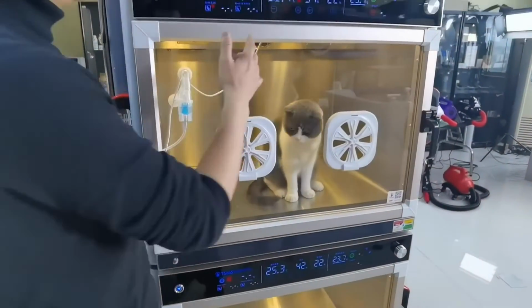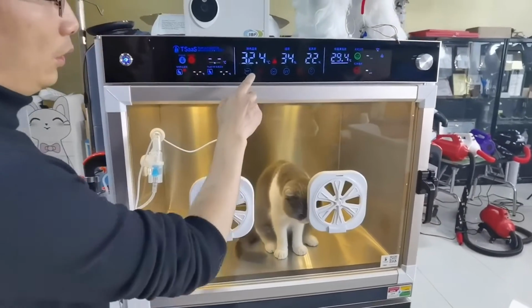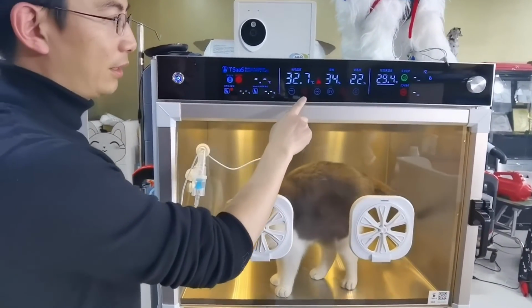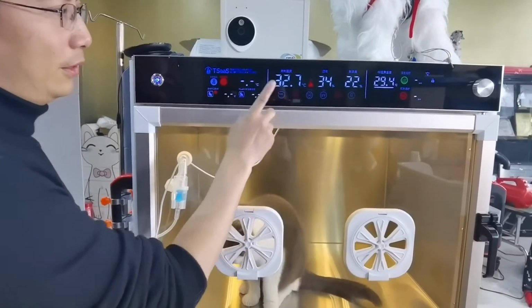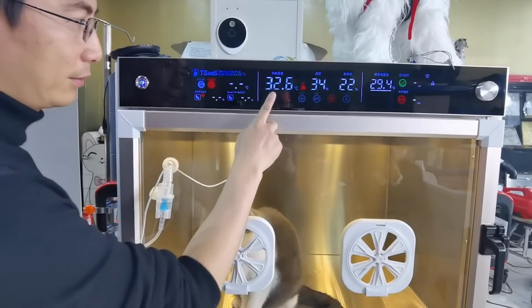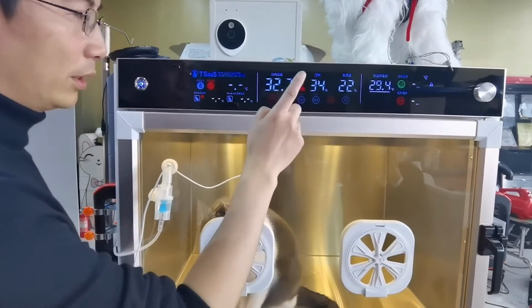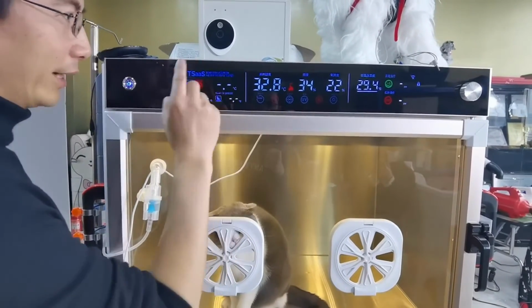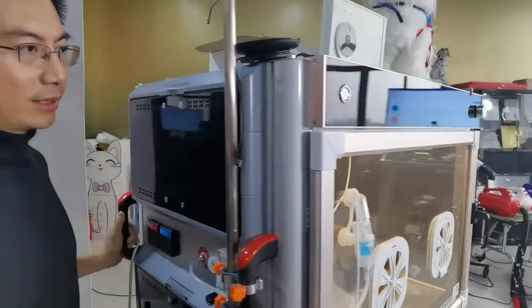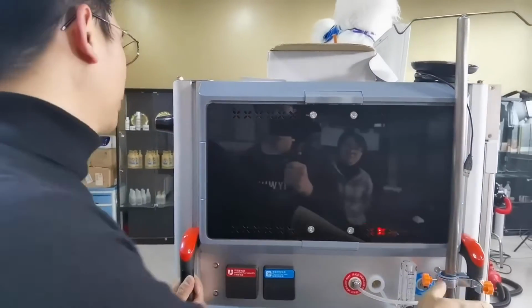When we move down here, you can see two icons. One refers to the external recirculation. The other is for the internal recirculation. Once I trigger this button, it's going to give you a bouncing noise. Ta-da! Okay, let's turn around and see the back end of the machine.